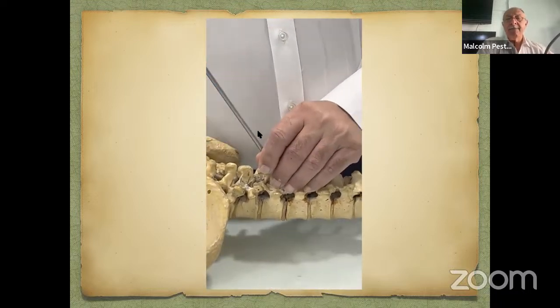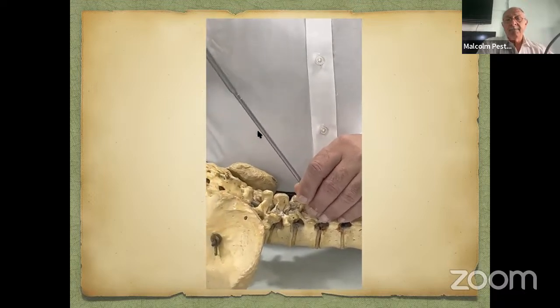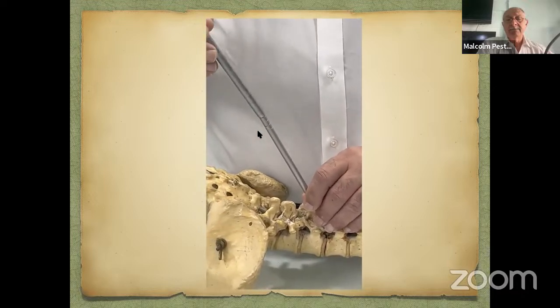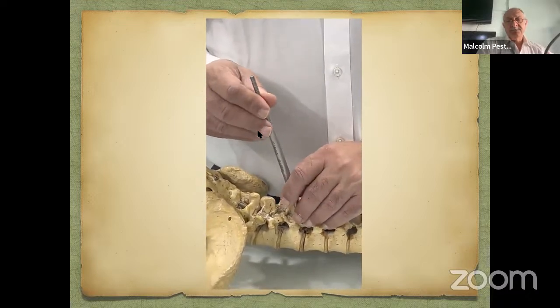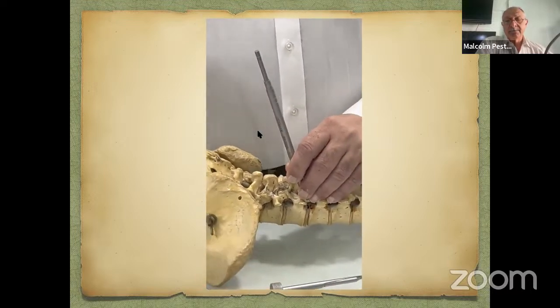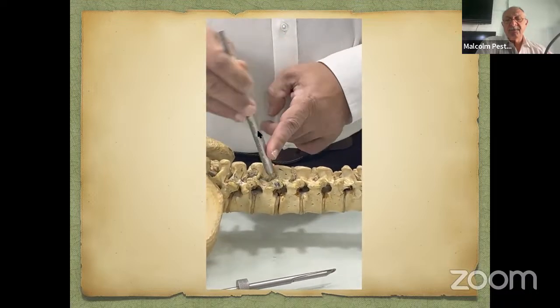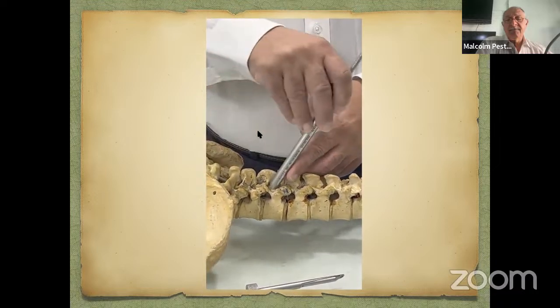I use a set of serial dilators to dilate my path to the spine. These dilators are all blunt. They will not go through, they will not hurt the spine in any way. But they will land you right on the muscle. Now I'm using a set of serial dilators. I start from 5 millimeters. I go up to 7, 9, 11, and 13. After I go there, I strip with these dilators across the interlaminar. I literally use them like a prop.